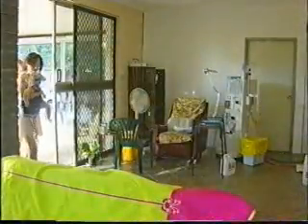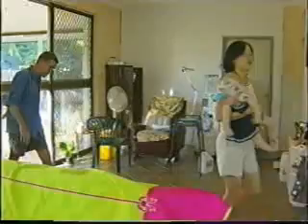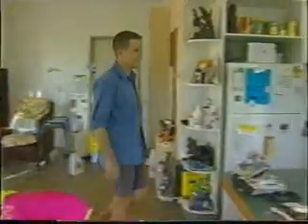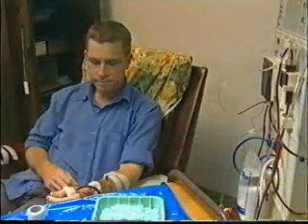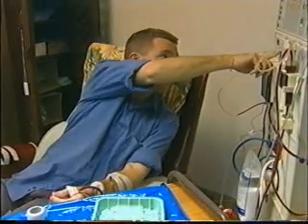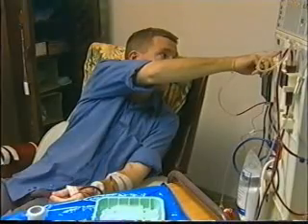We went to visit Mr. Harding, a man living with his family in Darwin, who has his own machine in his house. We asked if he'd tell us his story and show us. Mr. Harding was taught by the staff at the kidney unit in Darwin to work his machine.